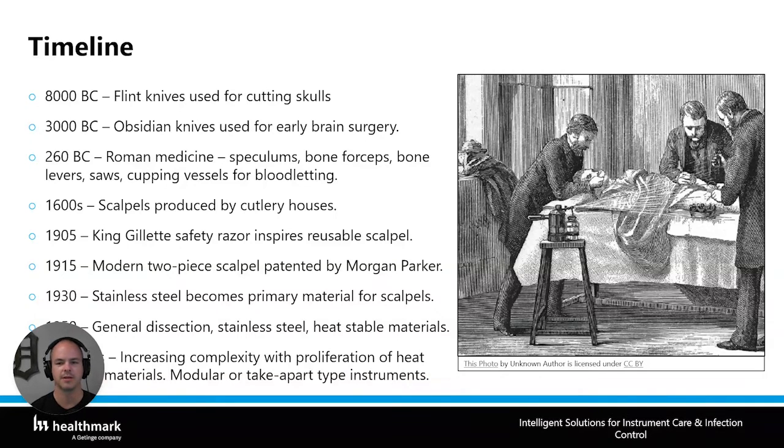One of the things you're going to want to remember for later is that in the 19th and 20th centuries, the reason surgical instruments started to really get produced at an increasing rate and widely proliferated was because of the development of both asepsis and anesthesia. And that's what that picture is there to remind me to tell you. That's a drawing depiction of Dr. Lister operating.